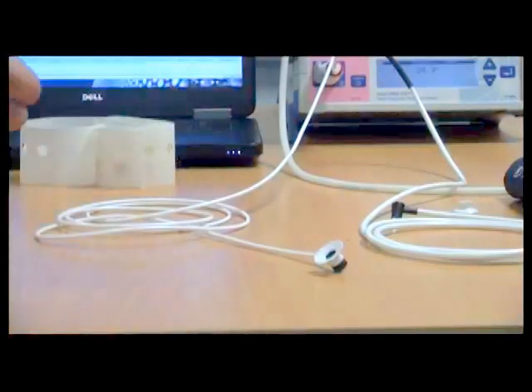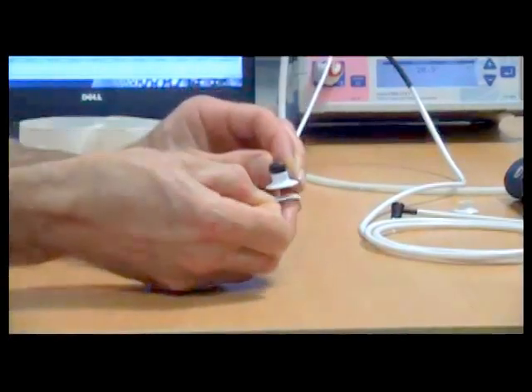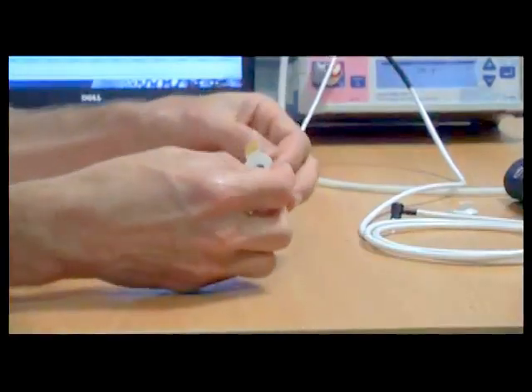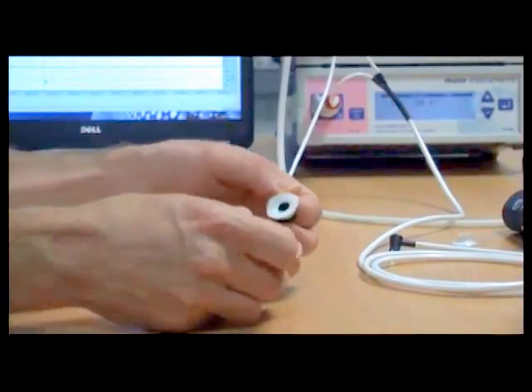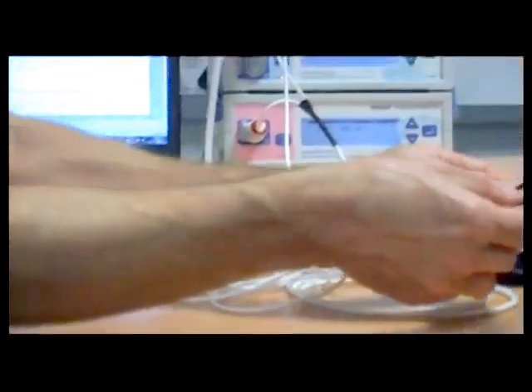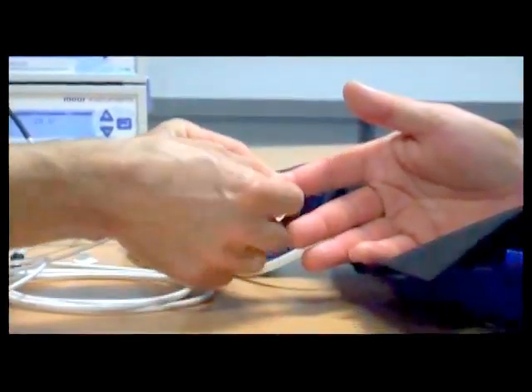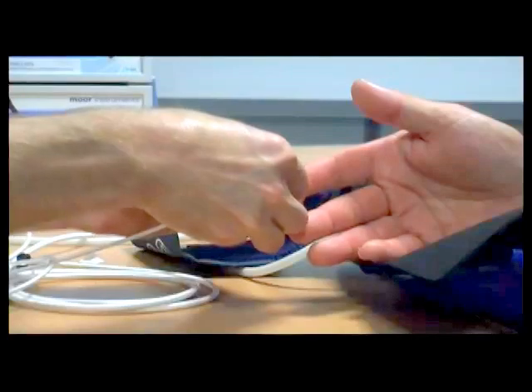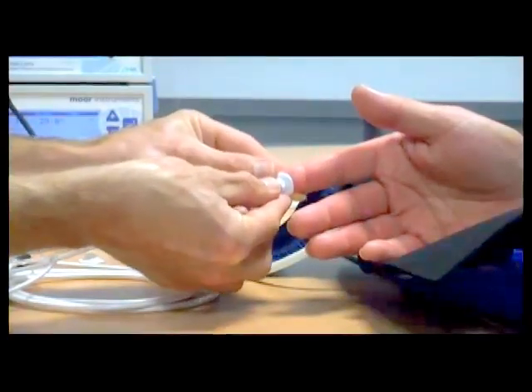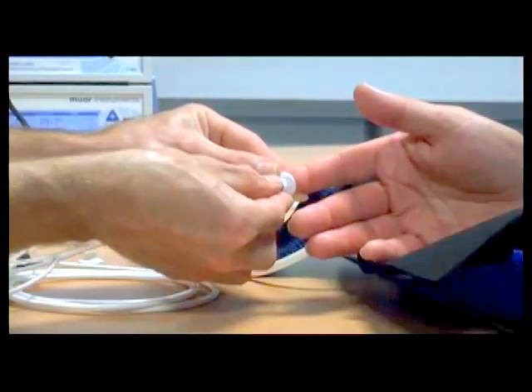So we attach the adhesive disc onto the probe holder, remove the back of that, and then apply it to the finger. Press and hold it for a couple of seconds to make sure that the probe holder is attached firmly and the probe's not going to come away from the skin during the measurement.